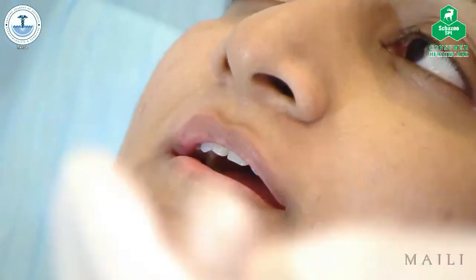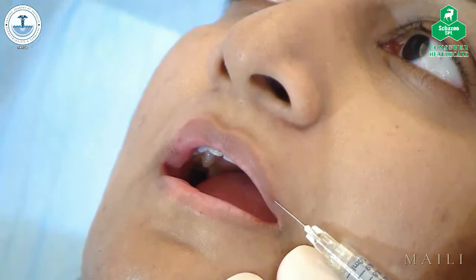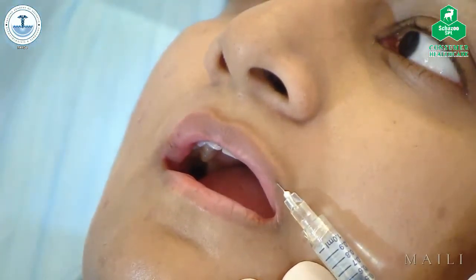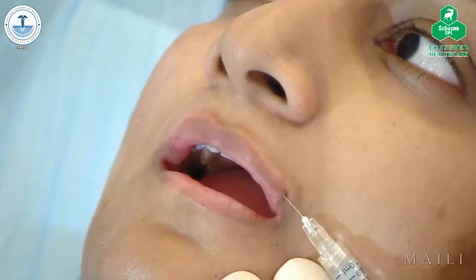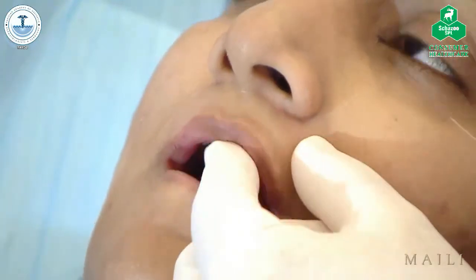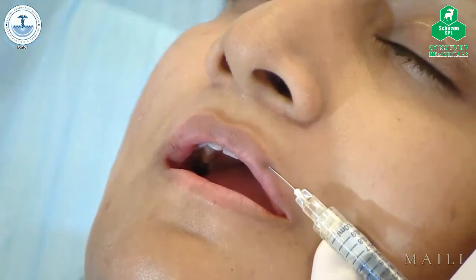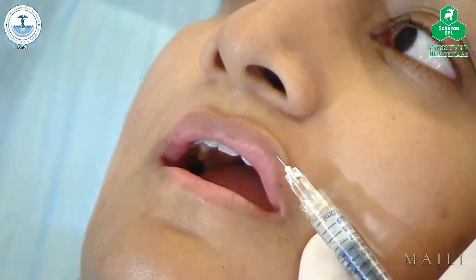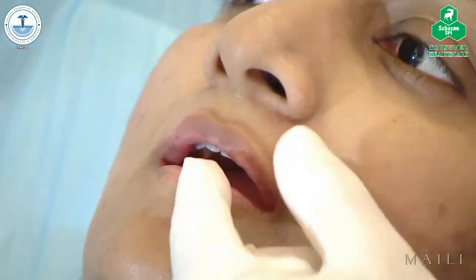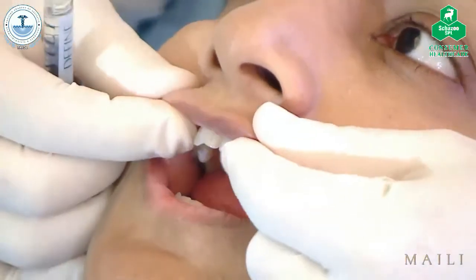Same principle, go from the depth to the surface. So I think that you can see a clear-cut difference. The same thing on this side. And you massage it, and another just more medially, because this side is a bit smaller than the other, I need a tiny bit more. That's it. So total 0.4 ml for the upper lip.